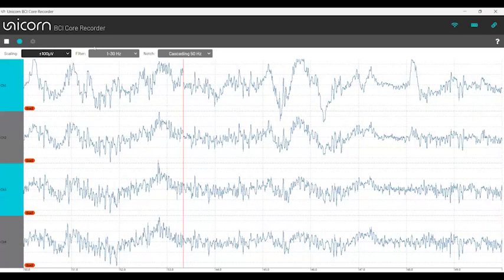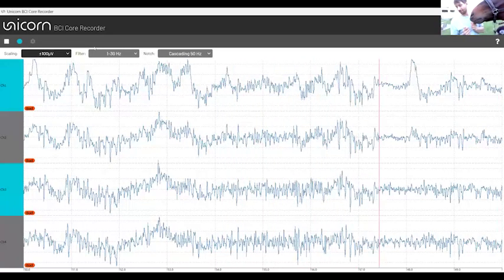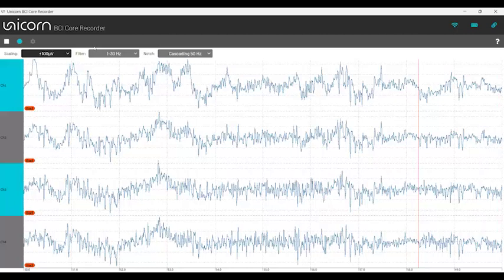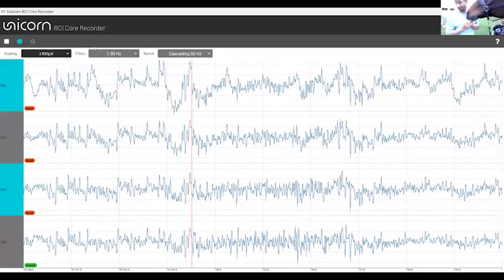Okay, you can also see how Dream is interested in the leg and in the food, not in the neuroscience. He's watching the screen a bit, but he's more interested in the food.